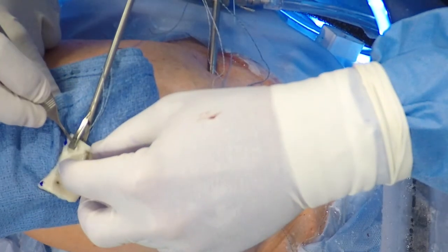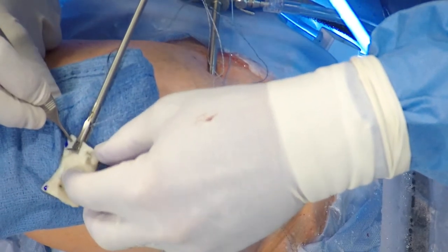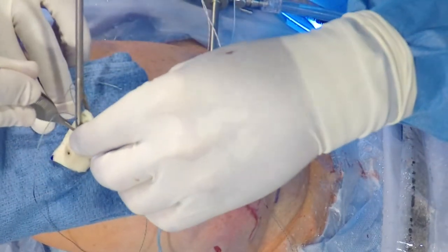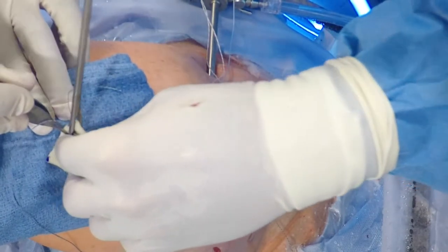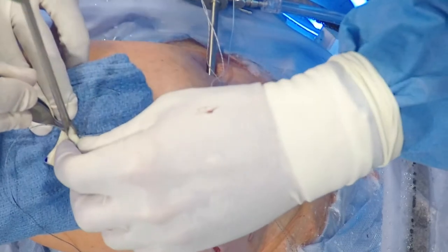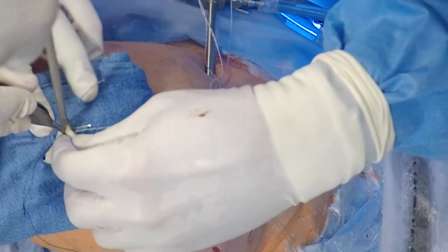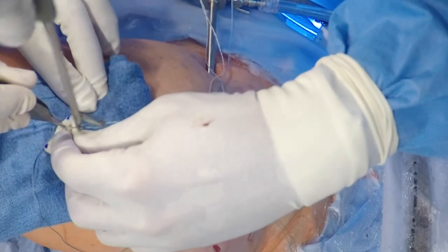We grab the loop, which will diminish the resistance, and it's important to maintain the right tension. The same will be done now for the more posterior of the two anchors in the glenoid, and the same process will be repeated. We will use that suture passer again in two different directions in order to create essentially a horizontal mattress stitch.